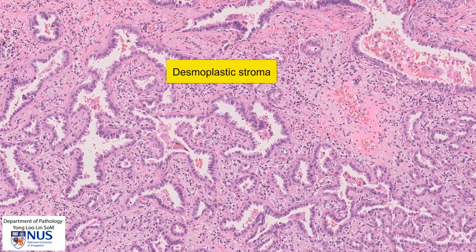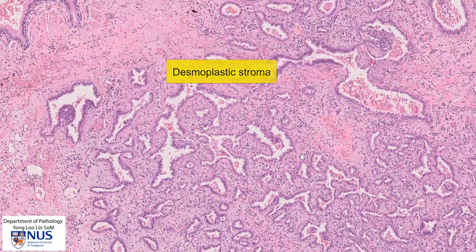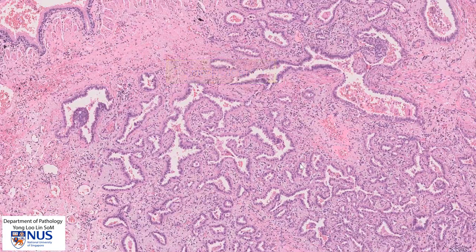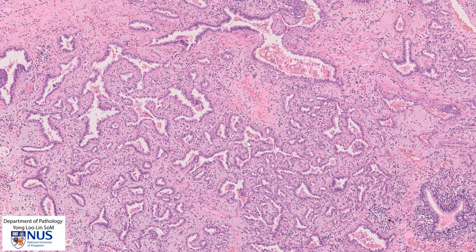This is desmoplastic stroma, which is a little more cellular, showing fibroblast proliferation and inflammatory cells — classically associated with invasive carcinoma. So we can appreciate the architecture of abnormal, complex, branching, angulated, irregular glands, and we can appreciate the desmoplastic stroma.